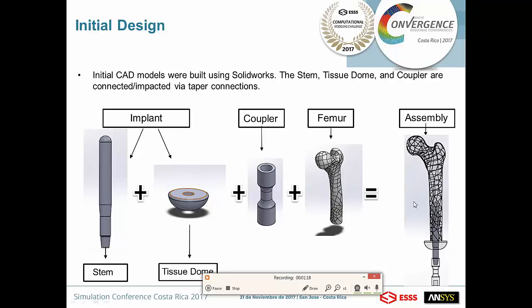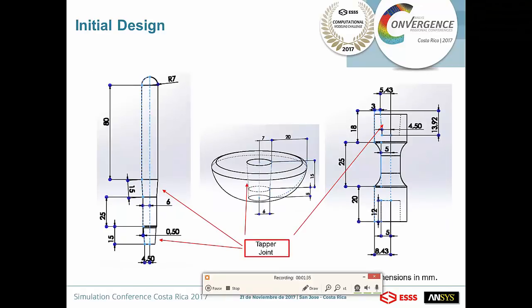So this is pretty much the assembly and all the parts that are going to be transferred into ANSYS in order to perform an analysis to evaluate if the implant and the coupler are going to support the patient's weight. We started with an initial design. These are the dimensions, and we perform an analysis in the simulation tool, like I said before.